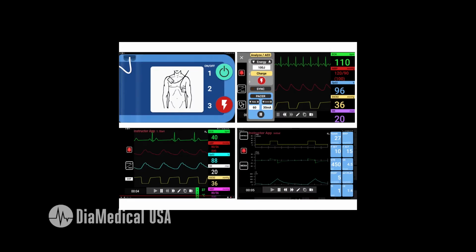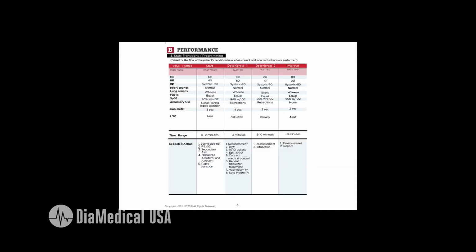This platform is very comprehensive and handles all echelons of care, starting with BLS with an AED simulator, progressing to EMS or hospital for codes with a defibrillator screen. Finally, we could move into more advanced areas such as the ER or critical care, and there we have a hospital monitor that includes an invasive blood pressure line, temperature, and then finally we have a ventilator application for patients receiving mechanical ventilation. So all in one platform you can simulate these four environments.